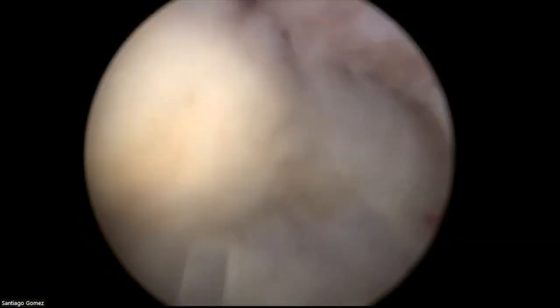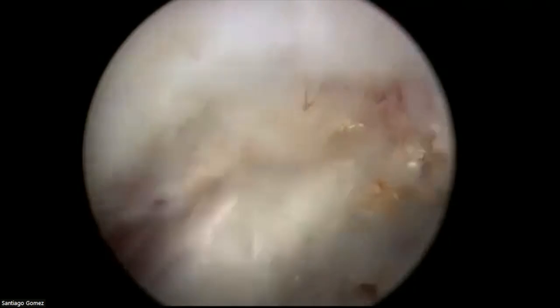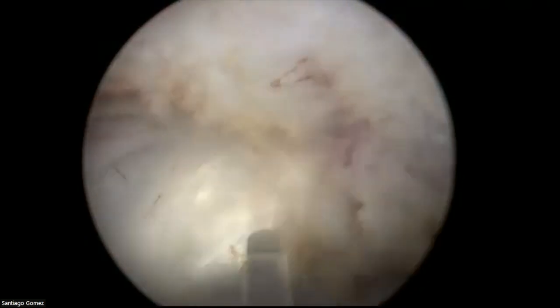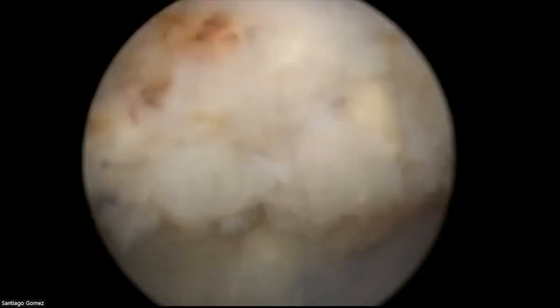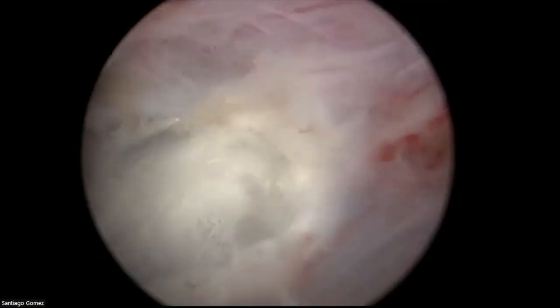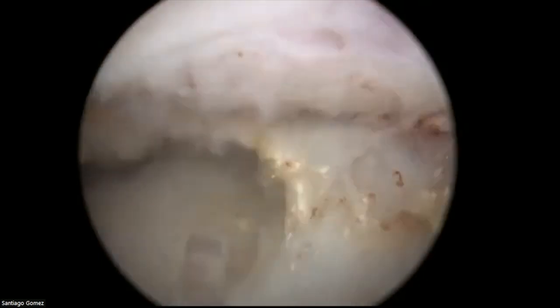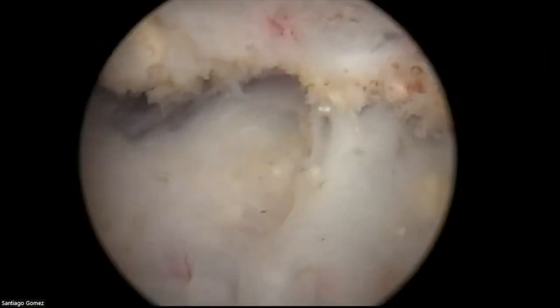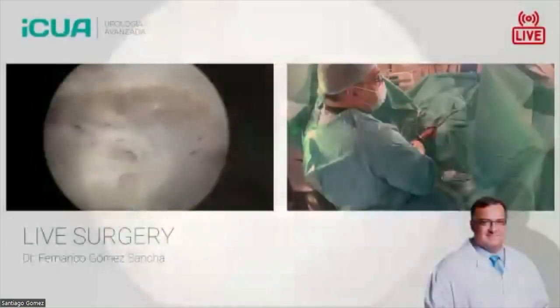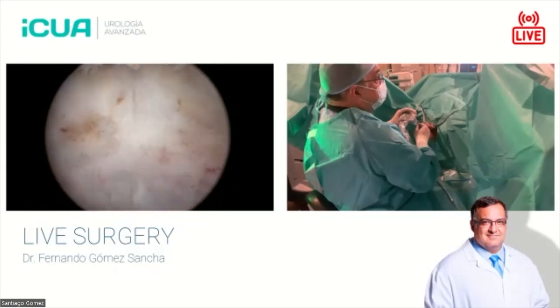So what I'm trying to say is you have to recognize the capsule and the interface between the adenoma and the capsule, not just by this beautiful look of the interface that we see sometimes. It's restrictive to try to see that all the time because it's not always there everywhere around the prostate. So sometimes you have a very nice plane anteriorly and a very bad plane posteriorly. So we have to start recognizing the capsule because of other factors. For example, one is the smoothness of the capsule. The capsule is quite smooth. You can tell the fibrosity of the capsule.